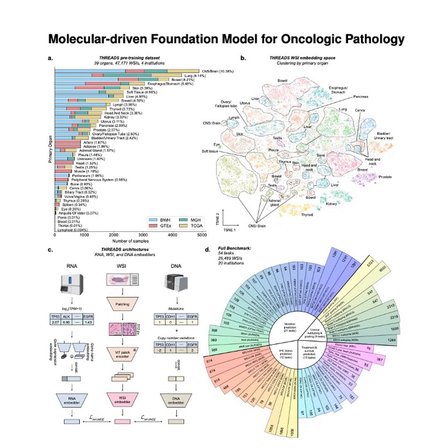These are scenarios where patient numbers are notoriously limited, and finding reliable predictive biomarkers is incredibly hard. So its robust, biologically informed foundation allowed it to generalize better from limited data where other models might struggle or fail. That seems to be the case. It wasn't just better on average. It was particularly strong precisely where we need AI help the most in these difficult, data-scarce scenarios involving rare diseases or prognosis. That's really compelling.